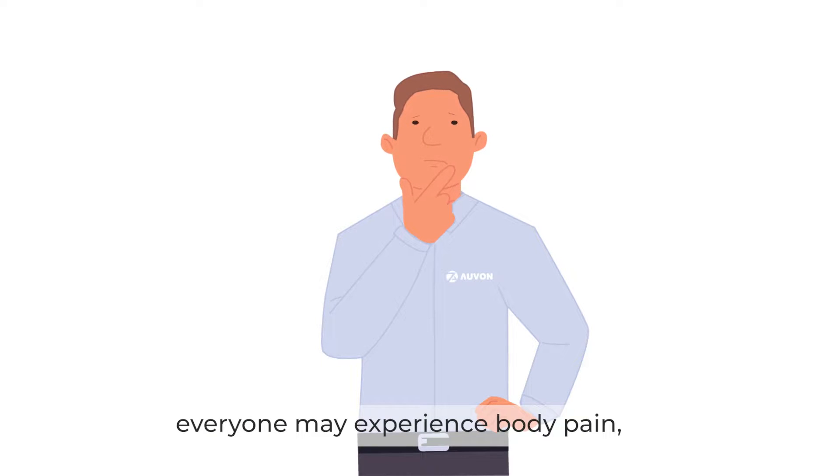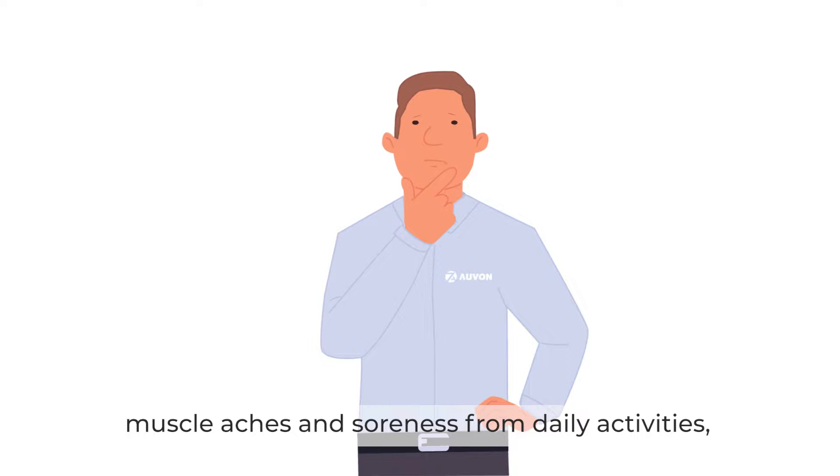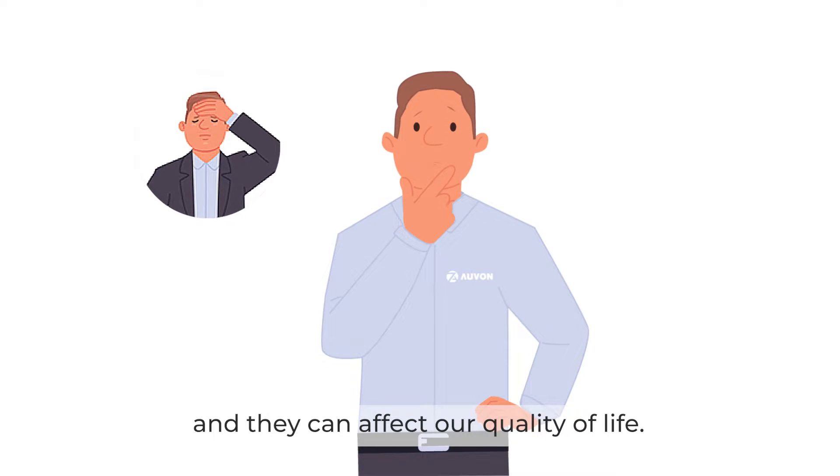In our daily lives, everyone may experience body pain, muscle aches and soreness from daily activities, and they can affect our quality of life.